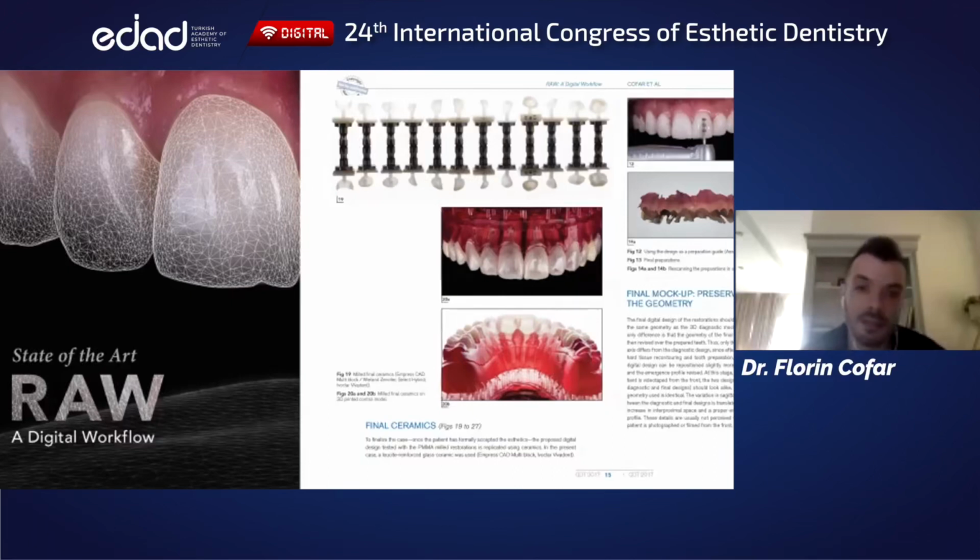The disadvantage of working in this way is that by default you will always be working with monolithic restorations, which means you will have less of an optical tool set than somebody who is layering. So at this moment in time, you have many advantages and a few bottlenecks, and I am going to discuss them both.